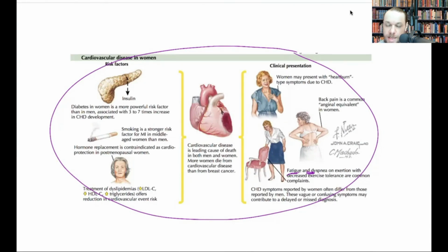And I'm like, not everyone comes in with chest pain, especially these patients. So do the 12 lead. No one is going to fault you for doing it, but you may pick up a lot of these atypical MIs. So do the 12 lead whenever you have diabetics or elderly females who complain of back pain, fatigue, all these symptoms. Do a 12 lead, all right?